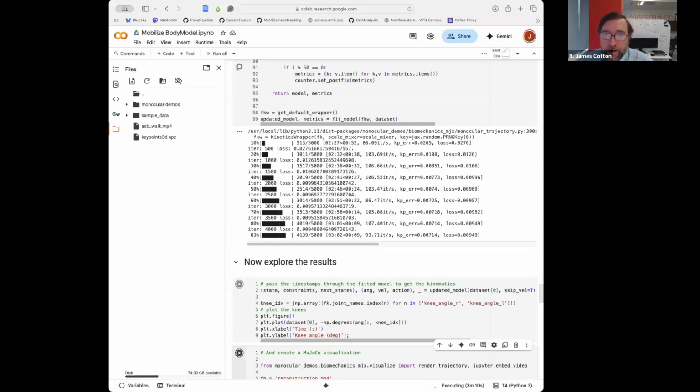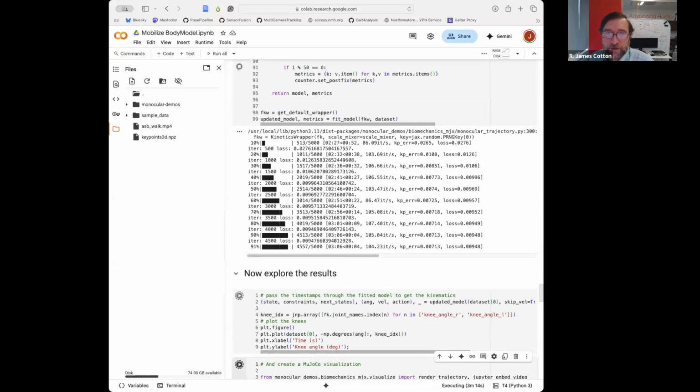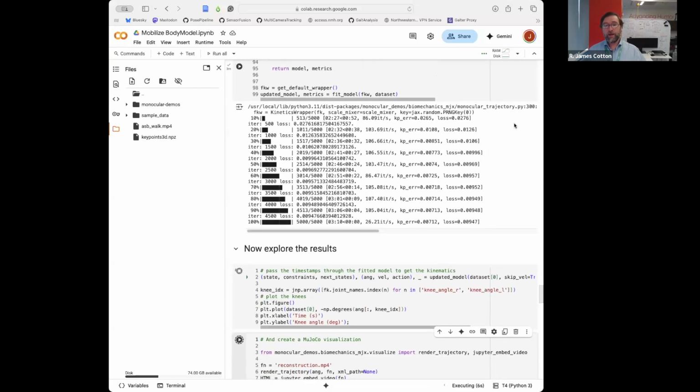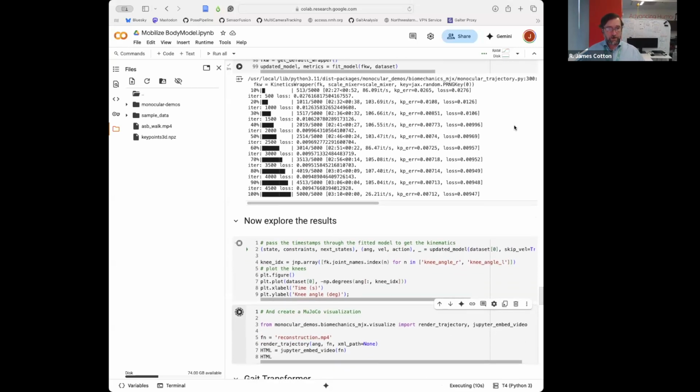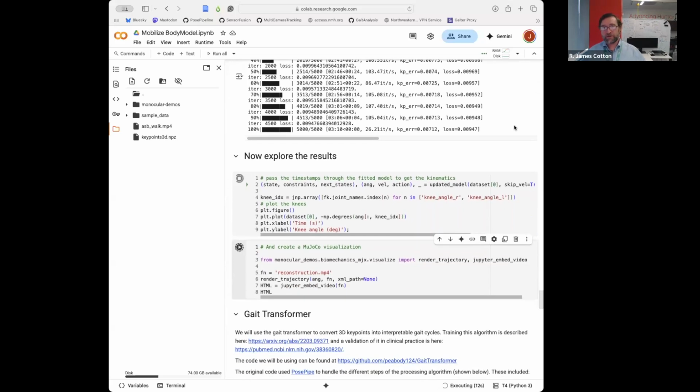Okay, what range of error in position is acceptable while validating the markerless motion capture key points using mono? Okay, so again, I'm just going to say the answer to all questions about what level of accuracy is acceptable: you can only answer that in the context of the question that you want to answer clinically, right? In my mind, our clinical standard in rehabilitation is a stopwatch. So almost every method is more accurate than what we currently use, provided it's at least reliable and we're not tracking the wrong people, things like that.